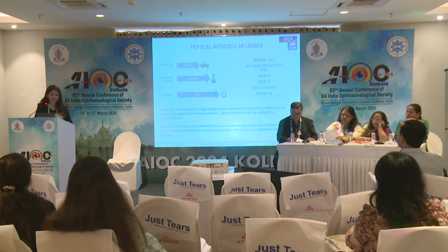We have the single monofocal lenses which provide a very good distance vision, but they do not help in intermediate or near vision.